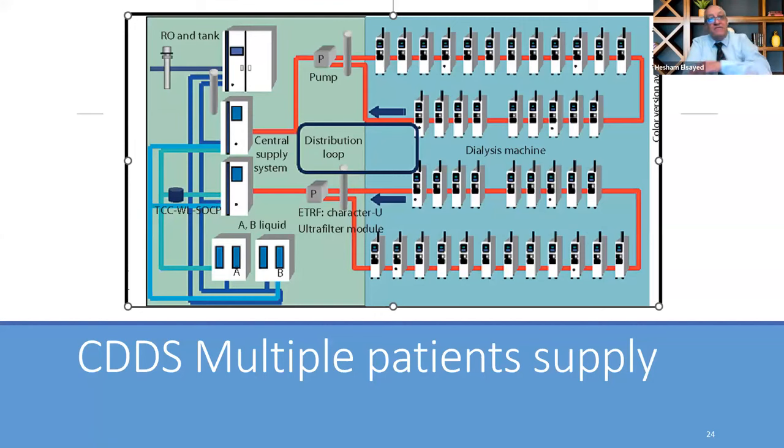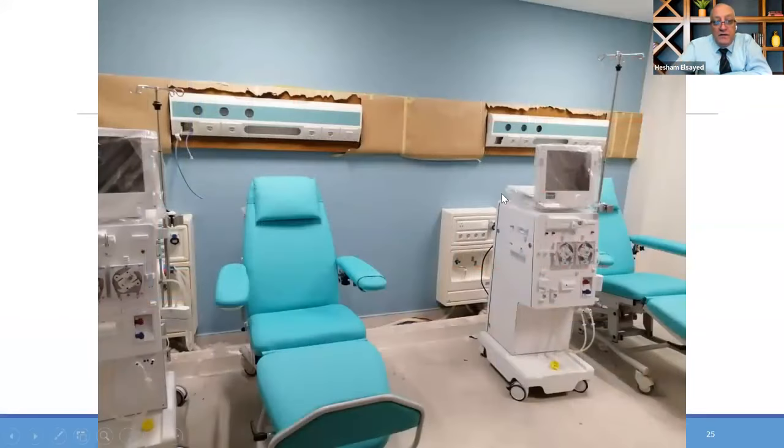Meaning that you don't have tanks inside the water treatment area. And if you look behind the hemodiafiltration machine, you can find the connections between the in and the out. It's a completely automated area. You will not find the canister, but you will still need a bicarbonate bag. In our clinical practice, we are using only acid fluids, so we can use a bicarbonate here. This is the control, and it can supply one or two machines in the unit.